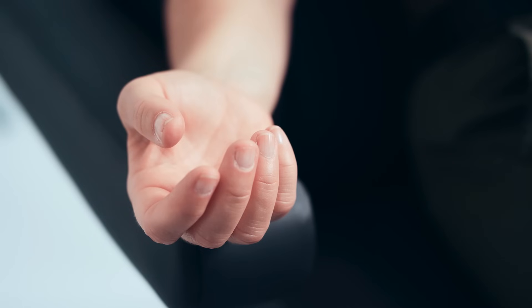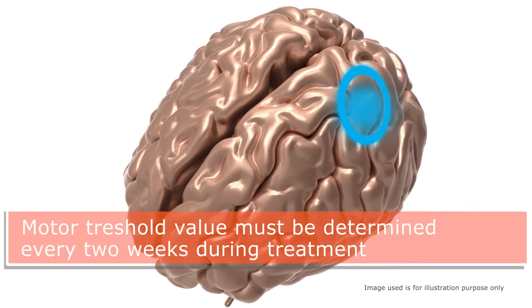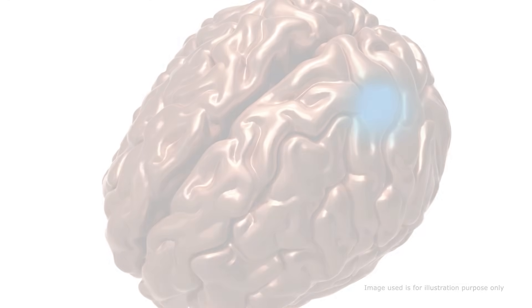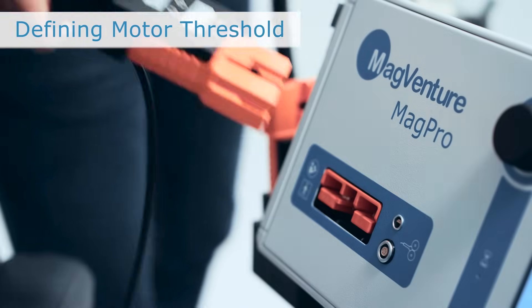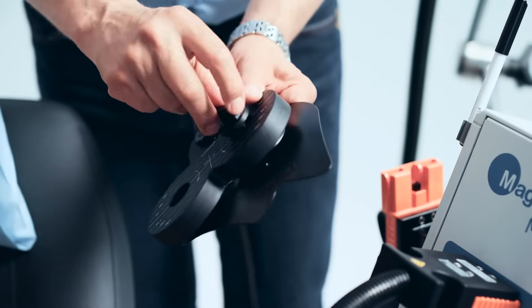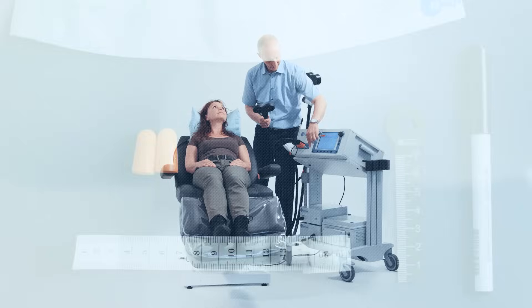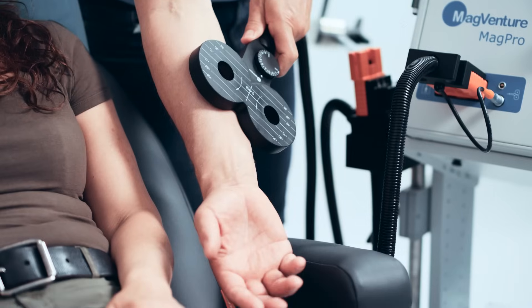Because the motor threshold in any given individual has been shown to be state dependent and variable, the MagVida TMS therapy protocol specifies that the motor threshold value must be determined every 2 weeks during the 6-week course of treatment. To begin a motor threshold determination procedure, turn on the MagPro and attach the CB60 coil. Ensure that the marking plate is attached. You will need a treatment cap for the patient, ear plugs, a marking pen, and measuring tape. For patients who are anxious about the procedure, applying a few stimulations to the forearm may be helpful to get the patient familiar with the stimulation.